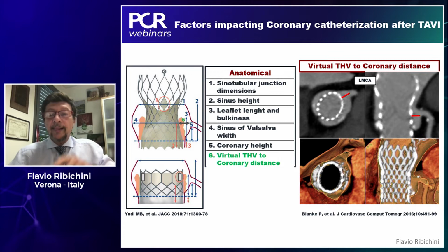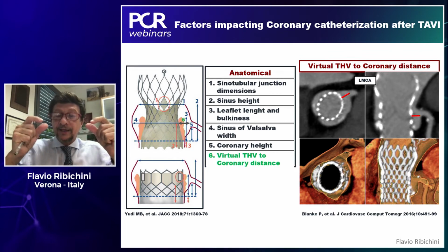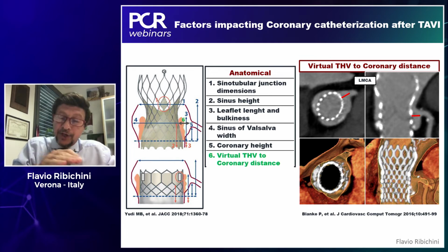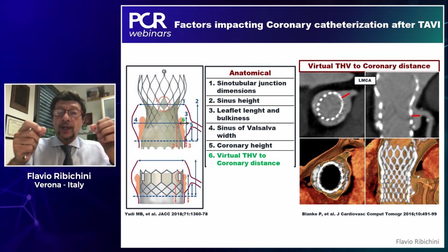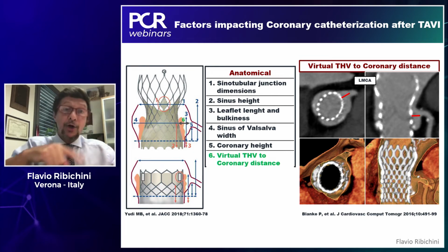This is why you see that the valve is above the starting of the valve. There is quite a high skirt of tissue, and the commissures are a triangle, and if the orientation is not good, this triangle will end up in front of your coronary. It doesn't mean that you will not get in, but you have to turn around, and this may be difficult.